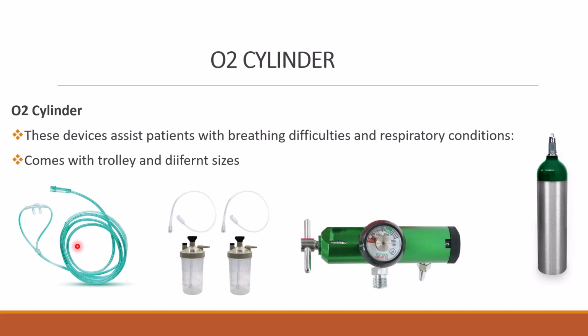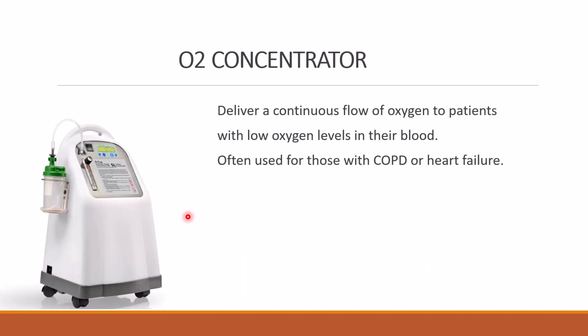But for more complicated cases, we can use oxygen concentrators. Here we use it to deliver a continuous flow of oxygen to a patient with a low oxygen level in their blood, often used for those with COPD or heart failure.